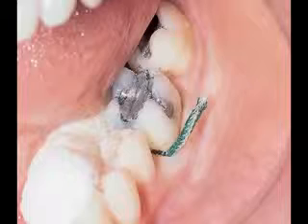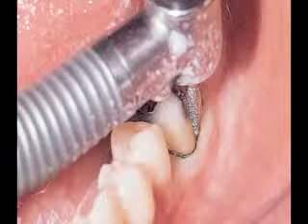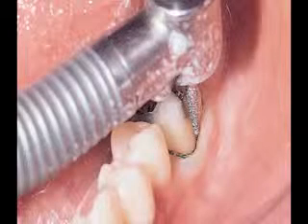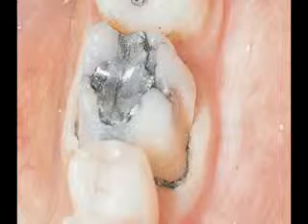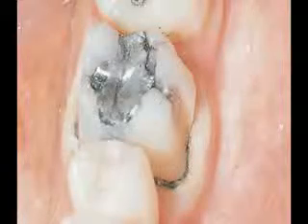Some dentists choose to pack a cord prior to subgingival tooth preparation. ULTRADENT's knitted cord will not entangle in diamond burrs during cutting at high speeds. Packing prior to subgingival margin extension helps protect gingival attachment. Tissue and fluid control is mandatory for other operative procedures as well.